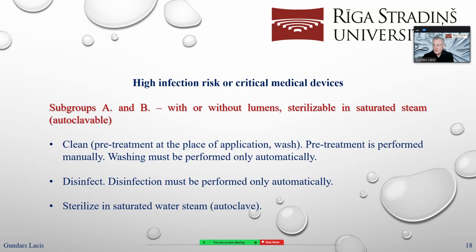Pre-treatment, as I said earlier, is always performed manually. Washing must be performed only automatically. Disinfection must be performed only automatically. And sterilization in saturated water steam or autoclaving.